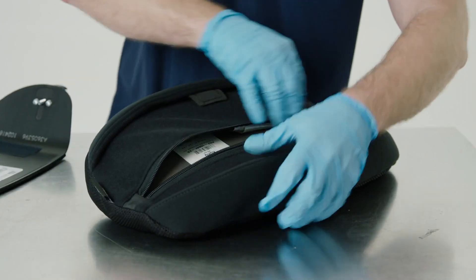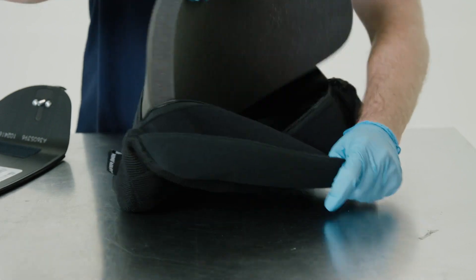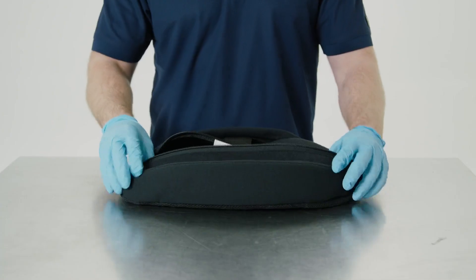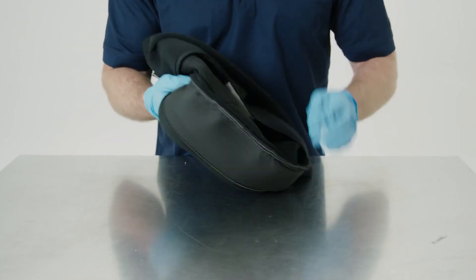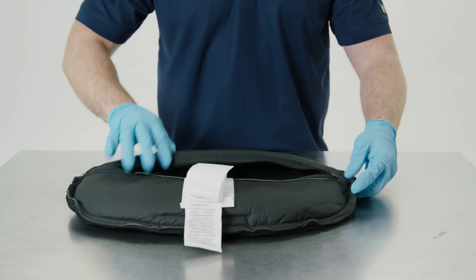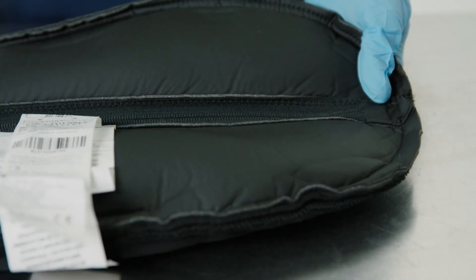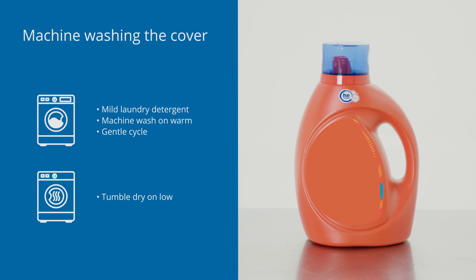To clean the cover, remove inserts from the cover first. Secure the hook and loop fastener strip on the handle. Turn the cover inside out and zip the cover closed to avoid any snagging. Machine wash the cover in warm water with mild detergent. Tumble dry on low.